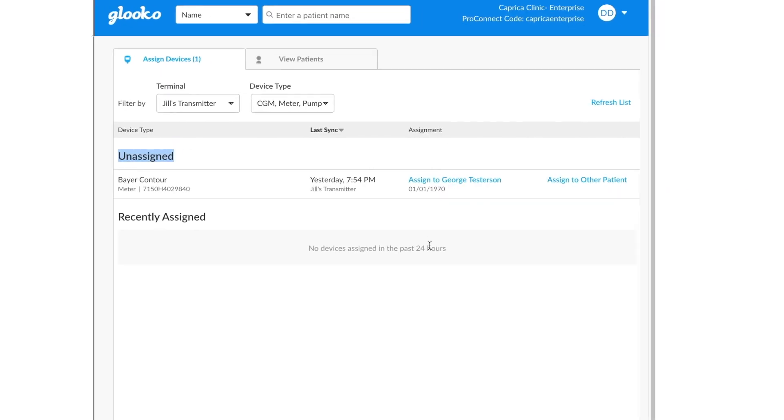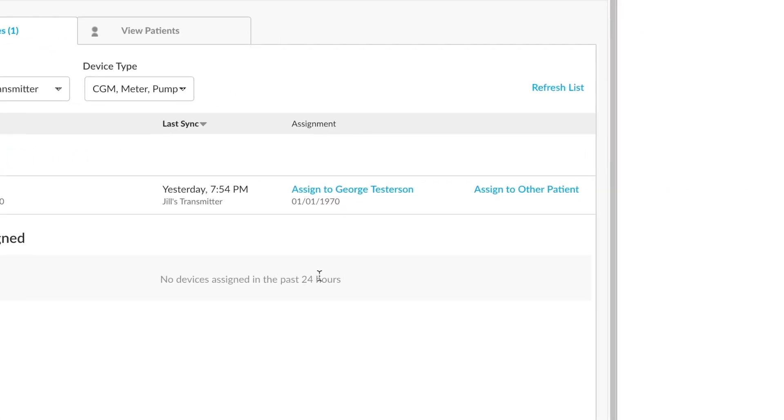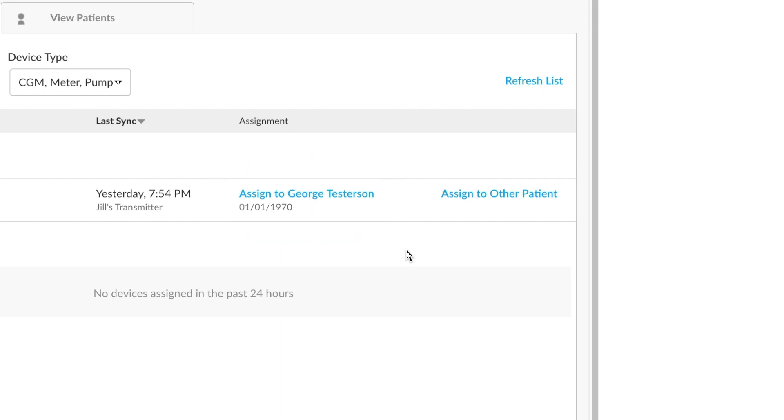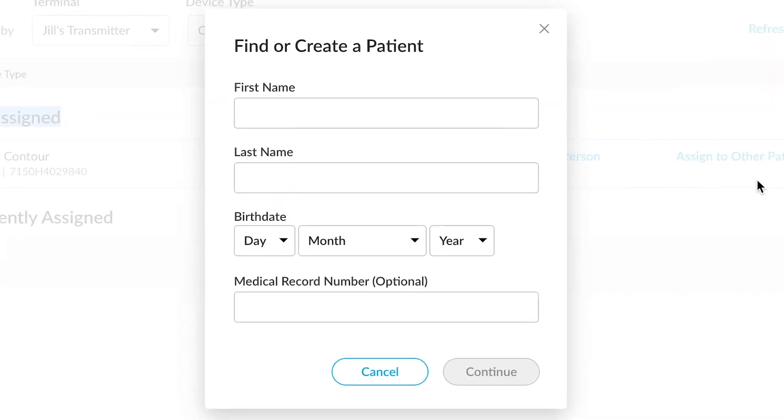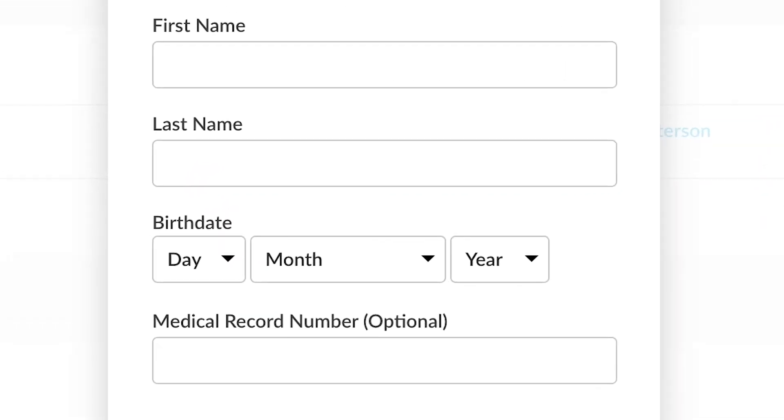If there is an unassigned device, you have the option to assign to a patient. Sometimes the system may already know who that patient might be from a past assignment. For instance, in this case, it's George. Alternatively, if it isn't George, you can always assign to another patient. Clicking on the Assign to Other Patient will give us some options.